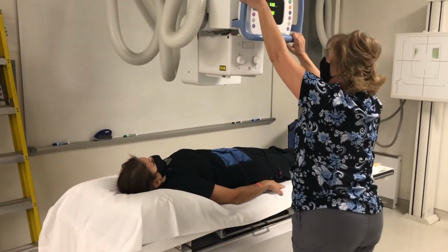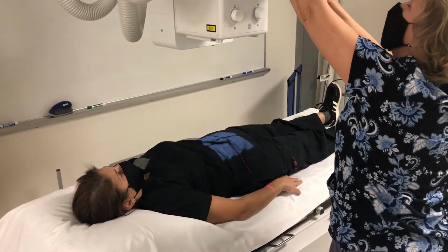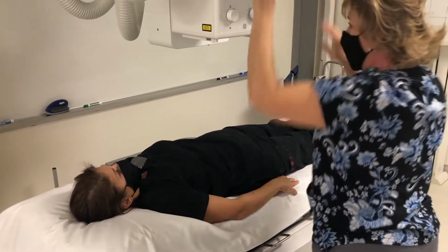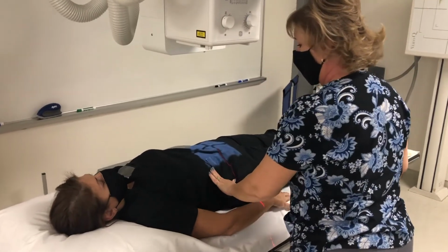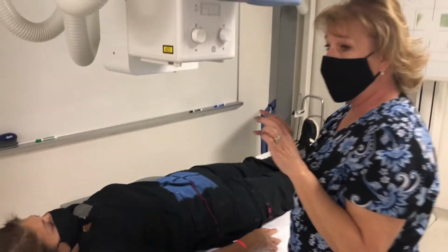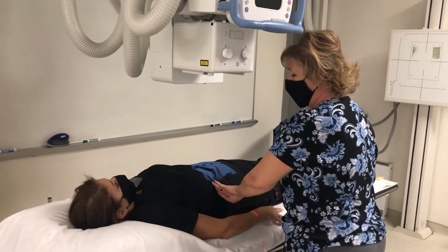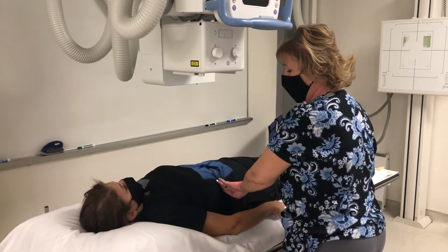And the kidneys are located around the level of L1-2. And this is where your scout will help you as well. You'll be able to see a shadow of the kidneys on the scout film. Now that we've injected contrast, I should be able to see her kidneys very well.